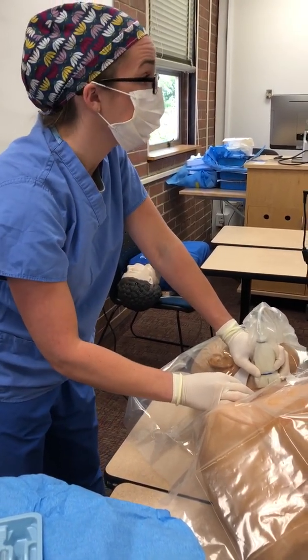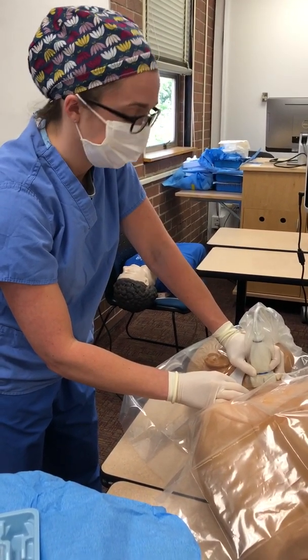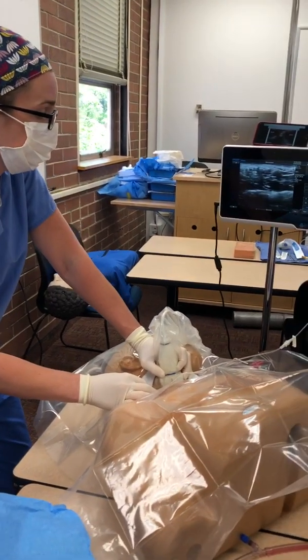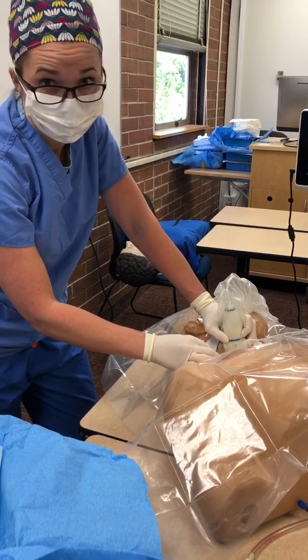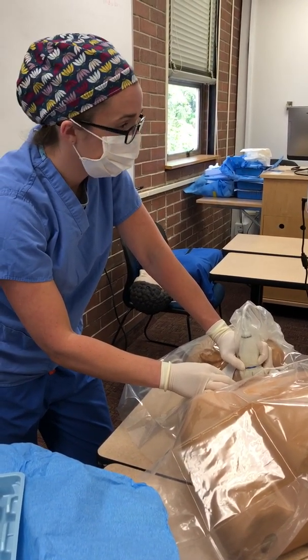So I'm going to have you aspirate. Just make sure that we're not in a vein. And we don't see any blood return. So I'm going to have you give just 1 ml of that local anesthetic. 1 ml is in. Okay. So this should ablate the twitch. So once it's ablated, I know that I am in the appropriate area.